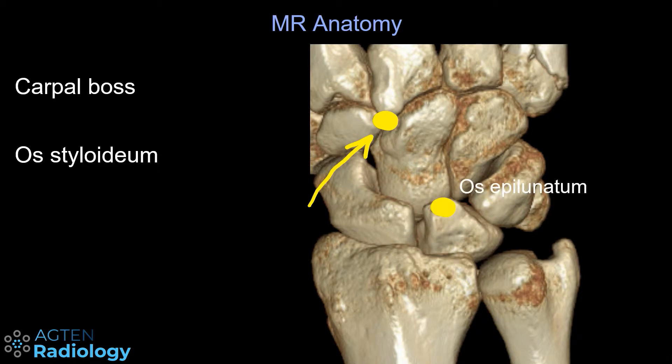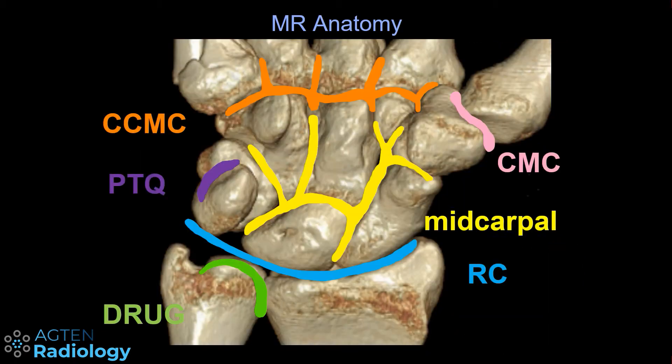If it's above the lunate then you can call it an os epilunatum, or epilunate ossicle. Now let's move on to the different compartments in the wrist.